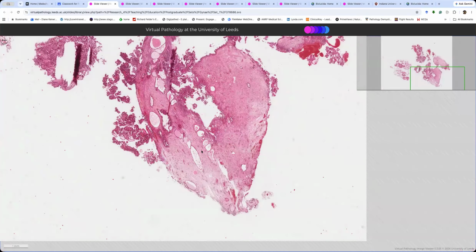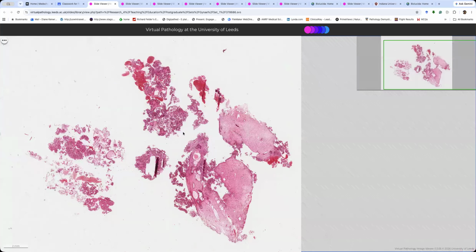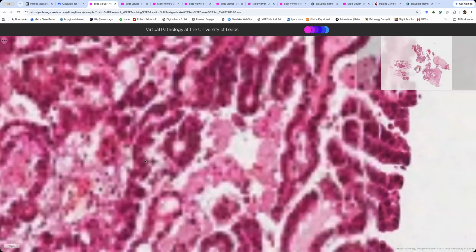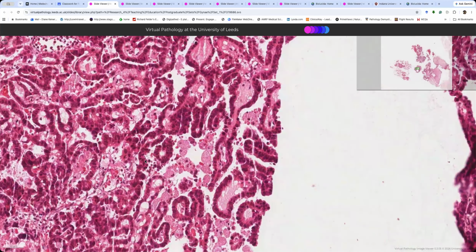It can metastasize from in situ, right? It's important to find. So this woman, if this was an endometrial polyp, it might be the end of it if it was taken out and you've missed the in situ. And if it was found, she would then go on to have a THBSO. Okay, so it's really important to look hard for it. Do you think we've got the kind of cytology of serous versus endometrioid sorted out? Yeah, good. Okay.